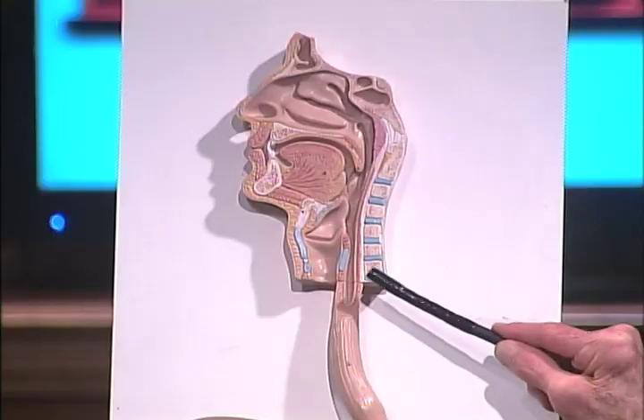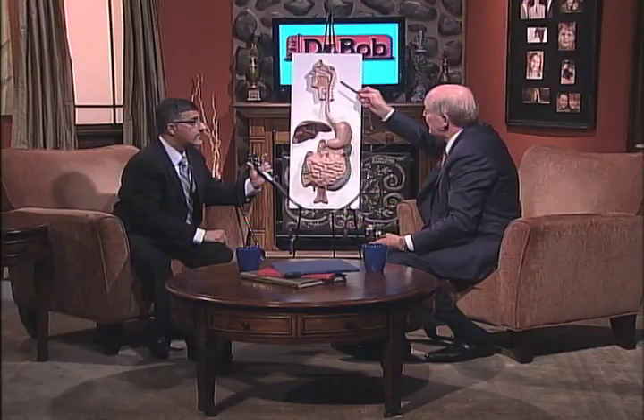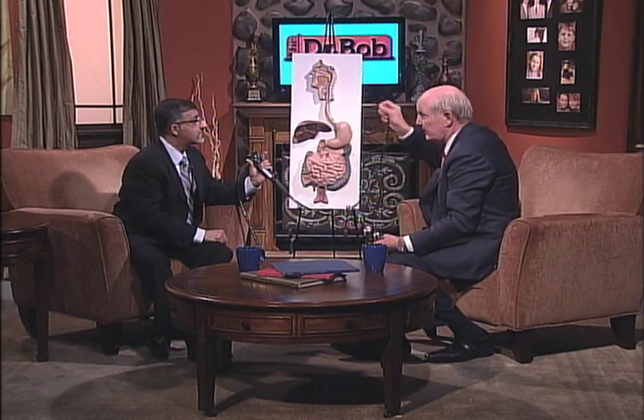Now let's talk about the esophagus. On this picture the esophagus is right here, like we're going to look down into the stomach. The mouth would be right here. Do you put this in the mouth and then start looking? Is that the way you do it?